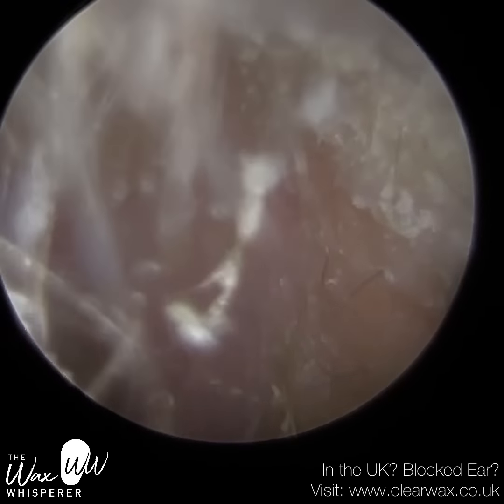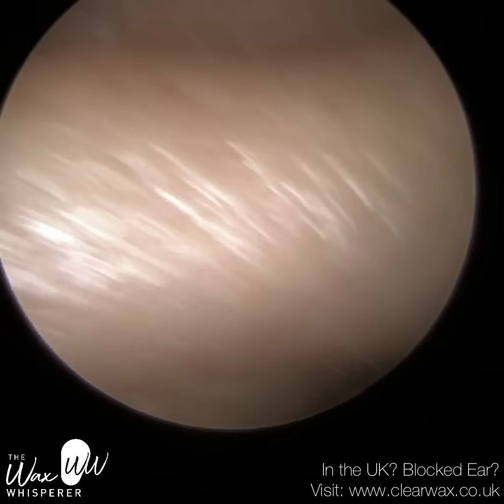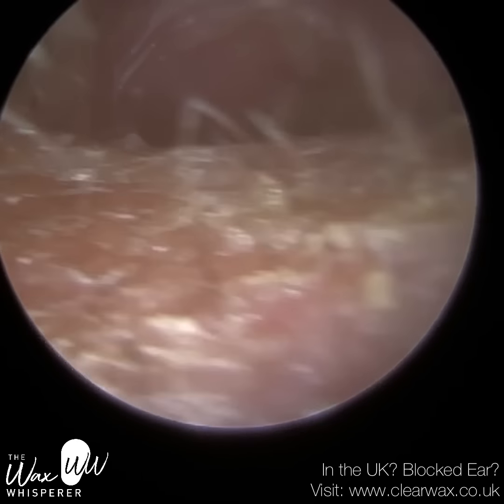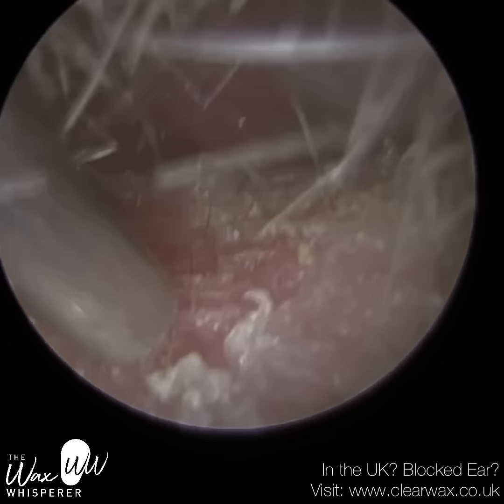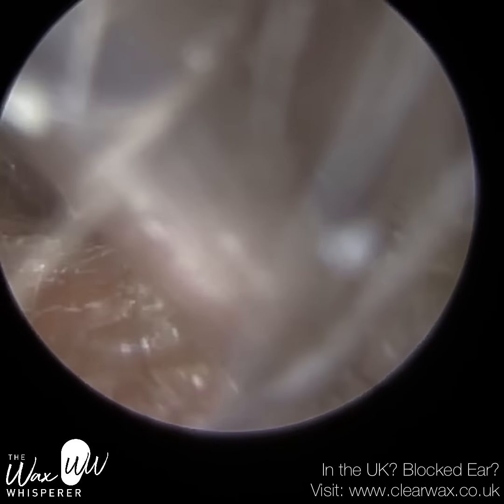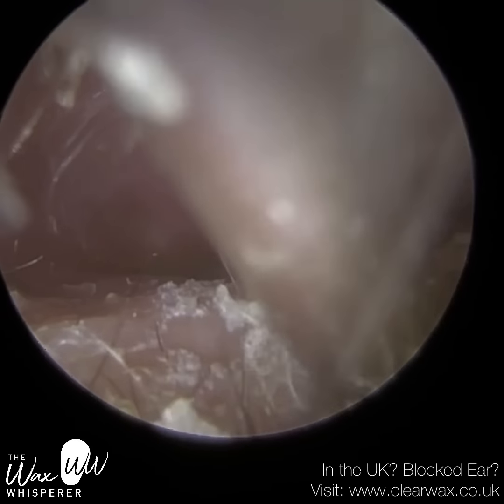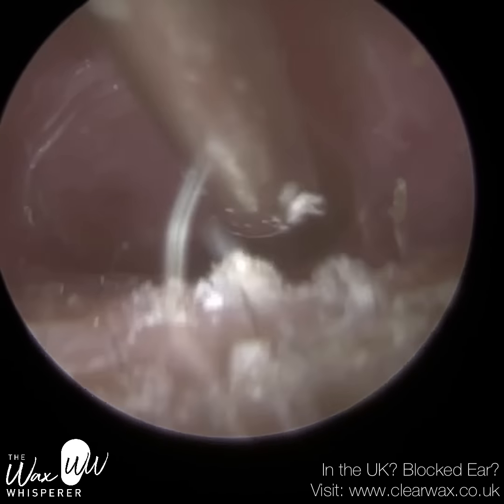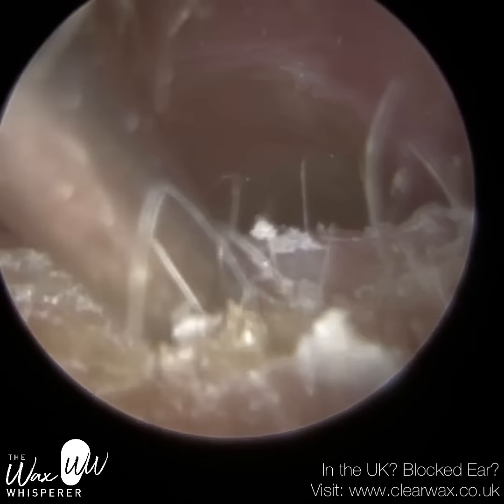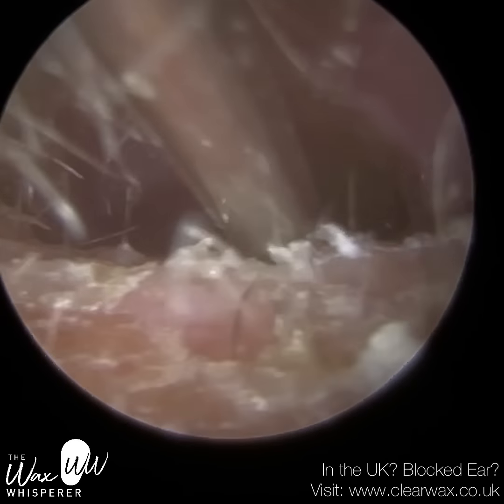But the problem is, because they're also suffering from this otitis externa, they're very limited in any treatment. Now, treatments, as I said, for otitis externa, these antibiotic sprays, which the patient can't have because these antibiotic sprays are known as what we call ototoxic. If they enter the middle ear cavity via the hole created by the T-tube, it can penetrate into the inner ear and cause permanent hearing loss.